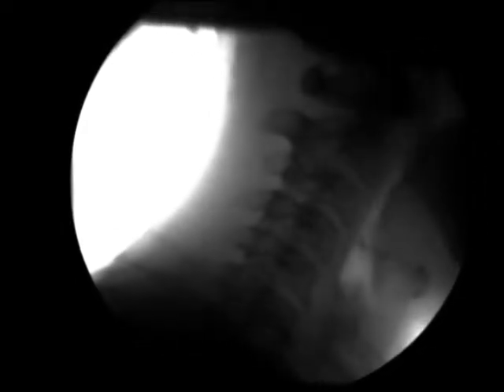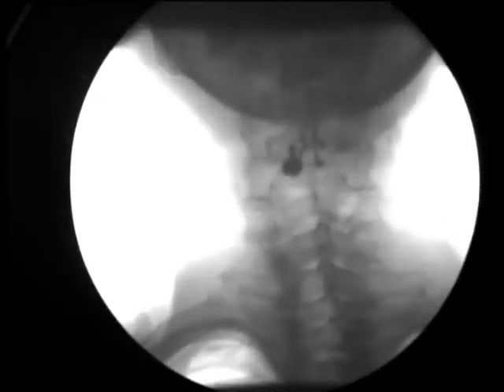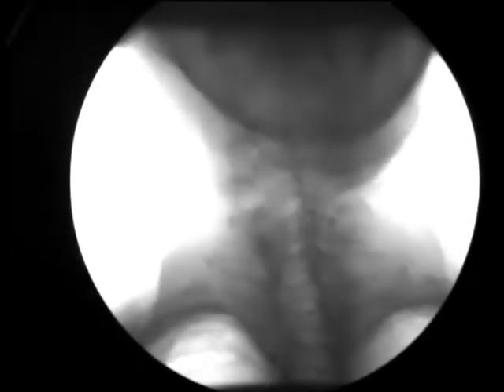And when we turn this patient, you're going to be quite surprised to see how significant this issue is, and the fact that a PEG tube was placed with no diagnosis of what the issue was. Was it swallowing? What was it? And even when we turn her, you'll see that the swallow looks fine. There's really no penetration or aspiration on the lateral view.